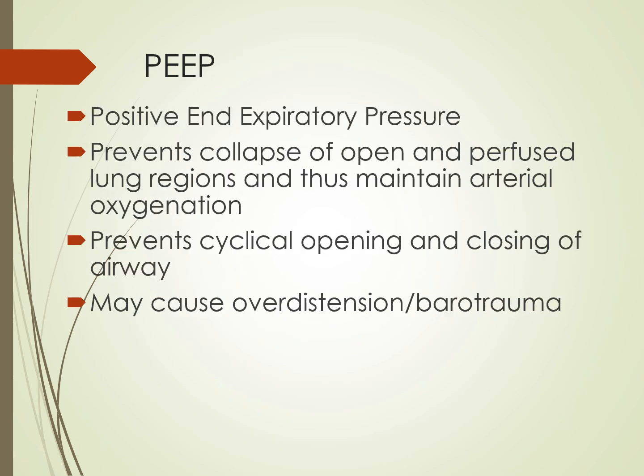I cannot overstate the importance of PEEP in the management of patients with ARDS. High PEEP can improve the PF ratio versus low PEEP. PEEP is an easily implemented intervention that is primarily used to prevent atelectasis and to correct hypoxemia caused by alveolar hypoventilation. Some studies that supported Borges show that the recruitment maneuver with PEEP and subsequent maintenance of a high level of PEEP reversed collapsed alveoli and improved oxygenation.